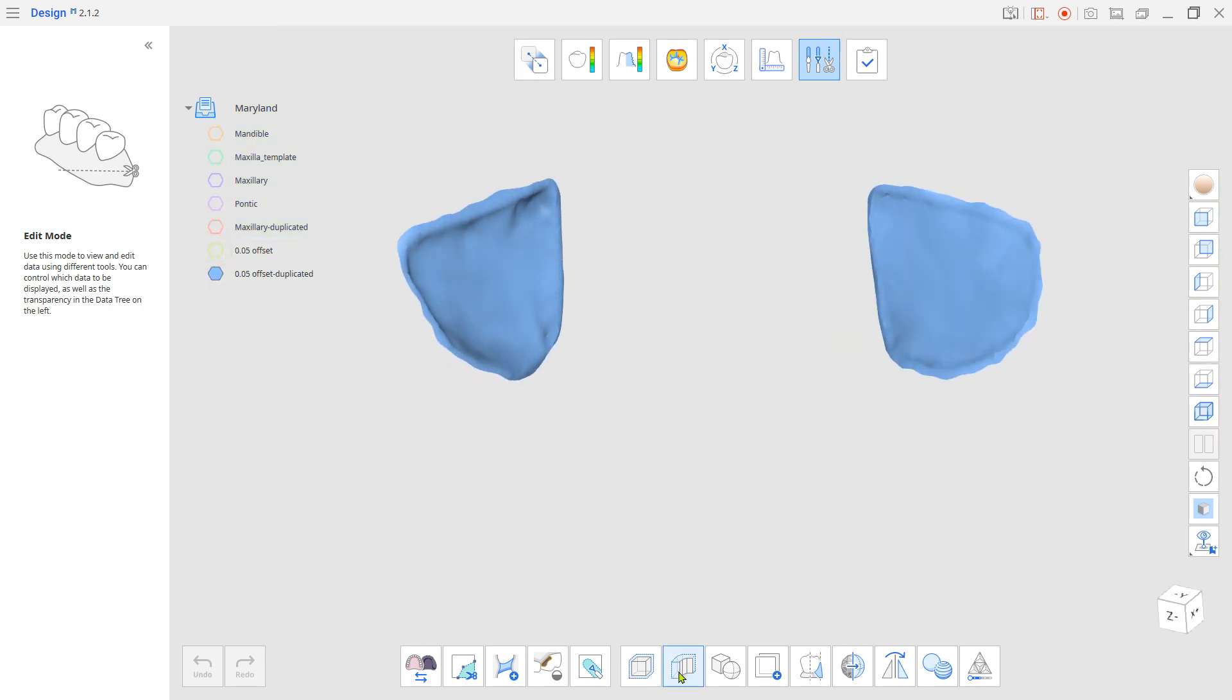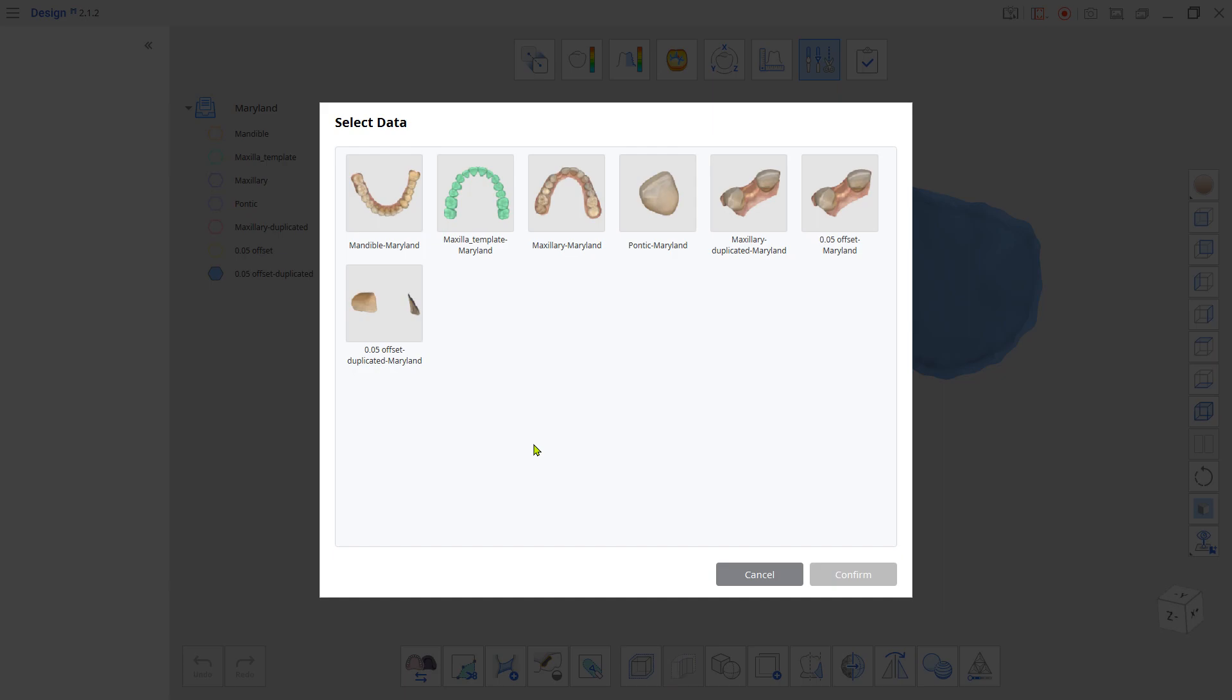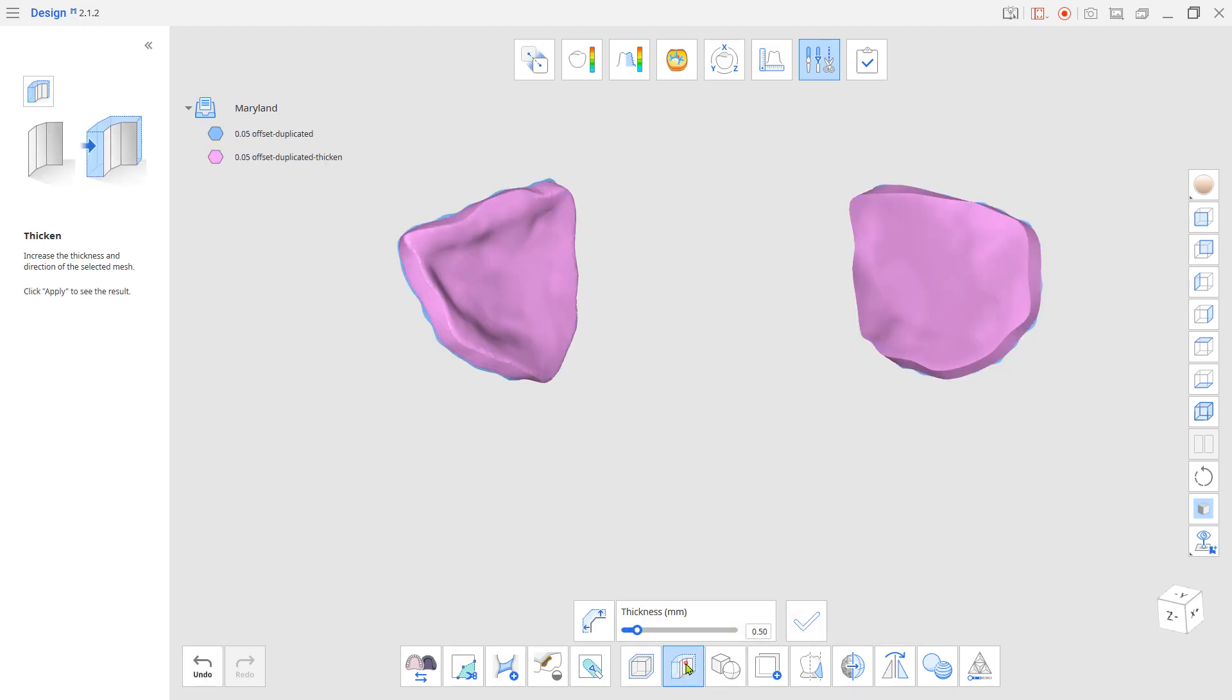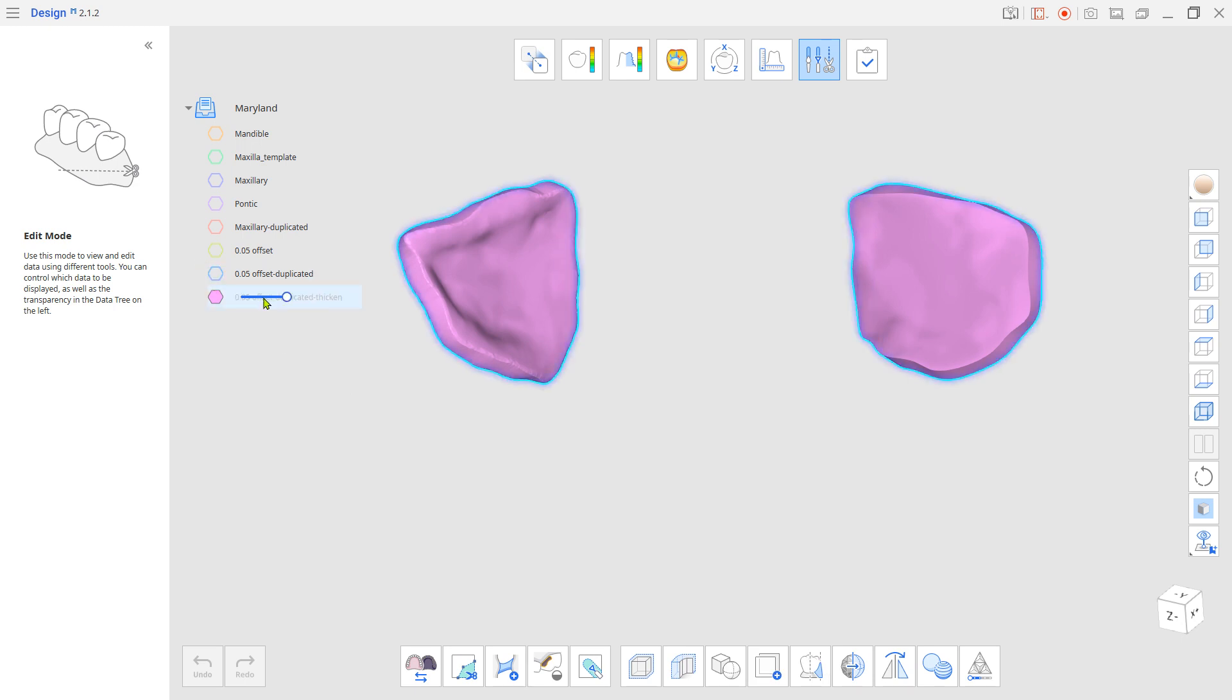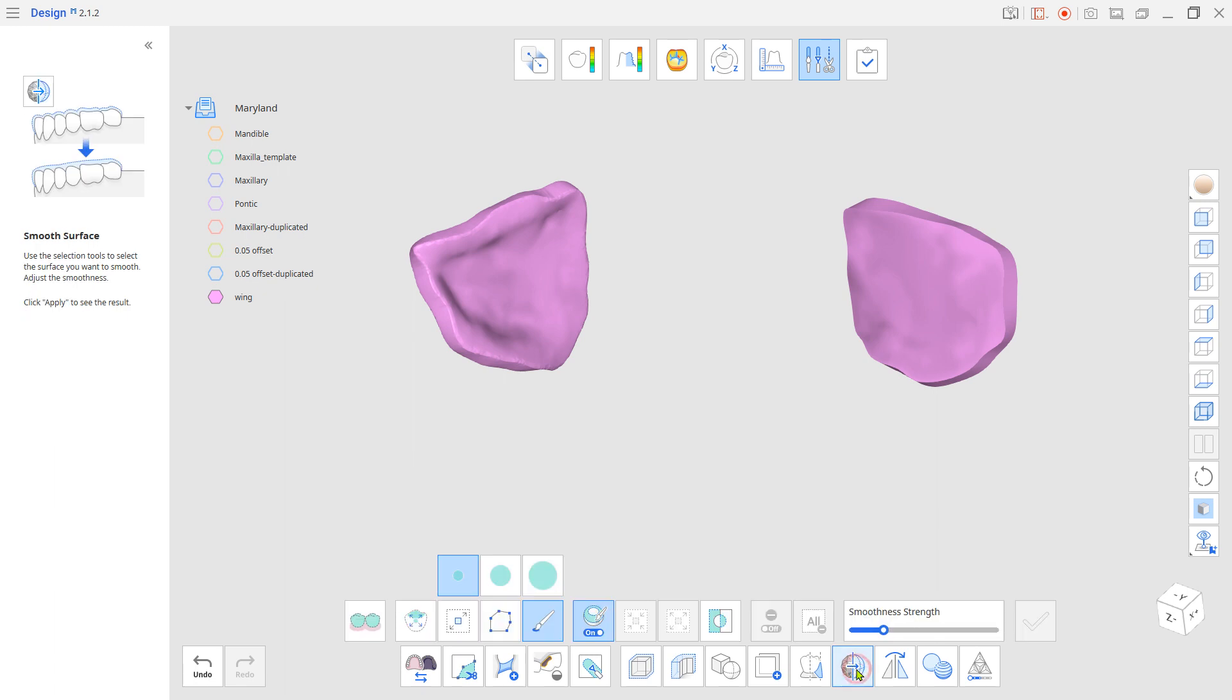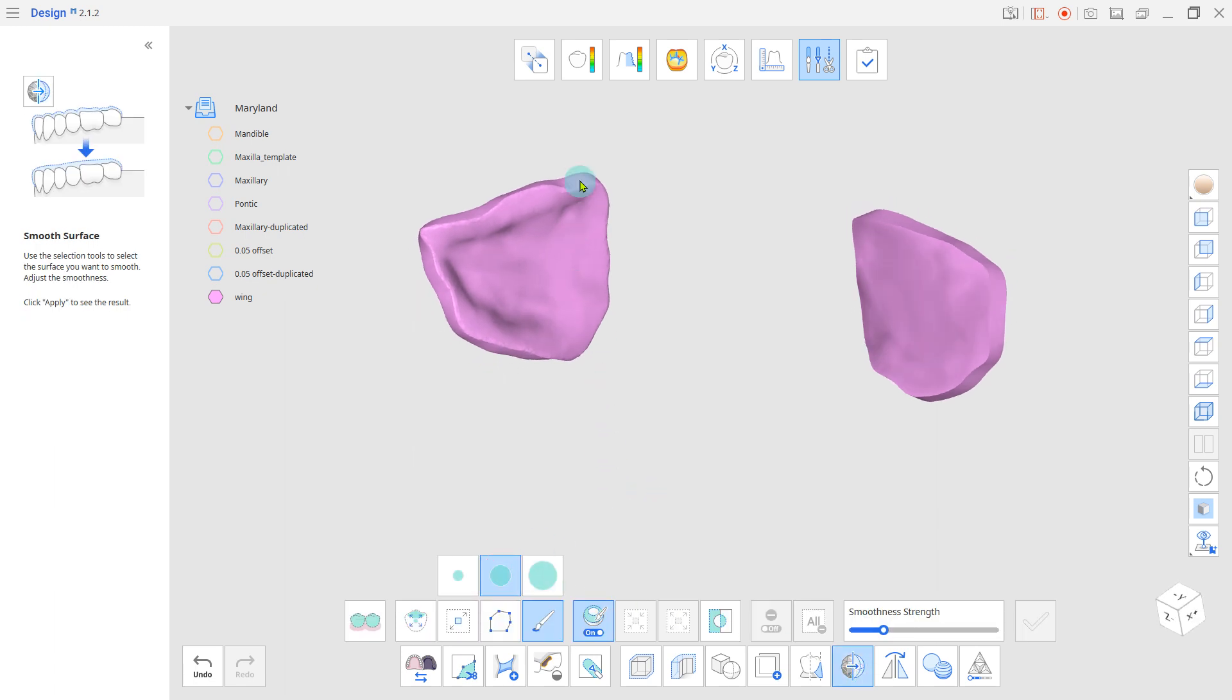Give thickness to the wings. And use the Smooth Surface tool to smooth out the edges, except on the connector side.